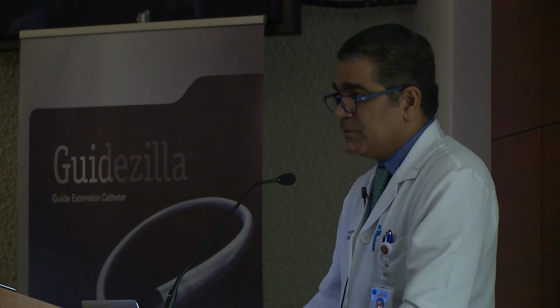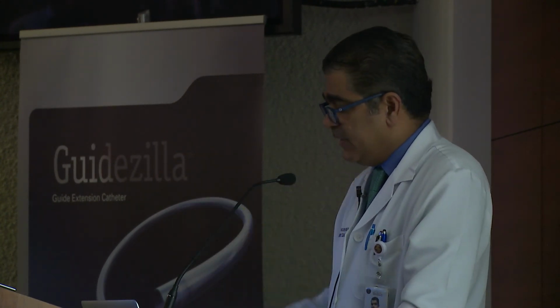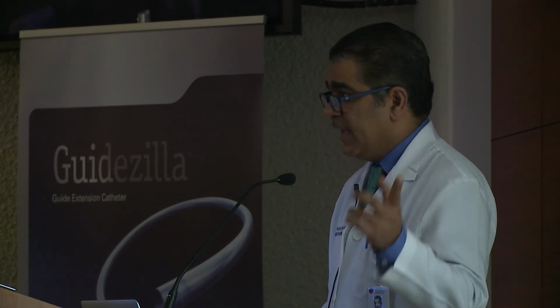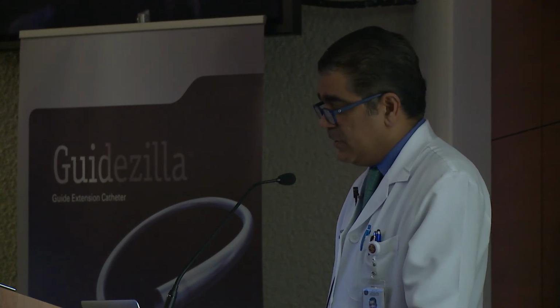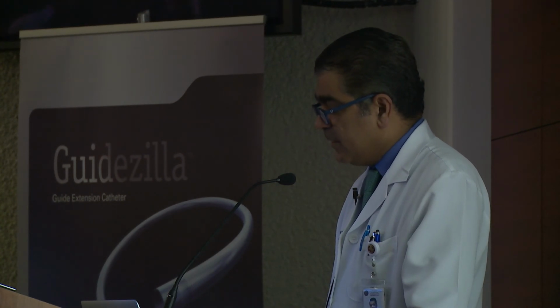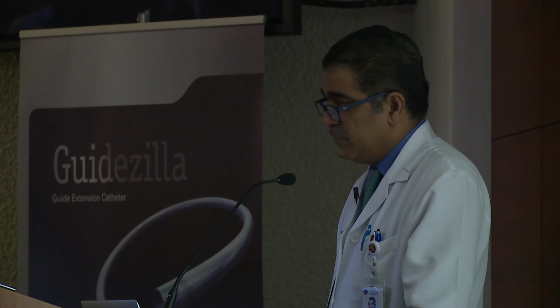The other thing is, once you go through the collateral and come back to your target vessel, you have to understand the concept of what I call the attack angle. If you come from the collateral with a distal RCA lesion like this, your attack angle is very short and acute, and you would not have enough push power. But if you come with an attack angle like this, it is much better. But there's also a solution for this.